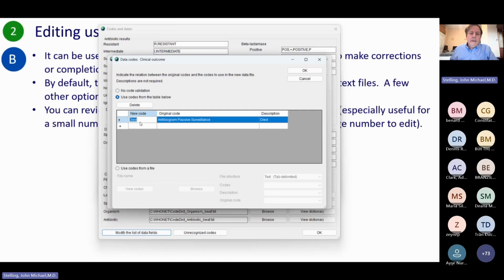your user lists. You can keep that here in a table specific for this BacLink configuration, or you can do it in a file like in Argentina, where they update the lists every year, and then they just have to send out the list to the other laboratories. They say, just save this list into this location, and then everybody gets the updated list. Okay. So that's a very valuable feature.